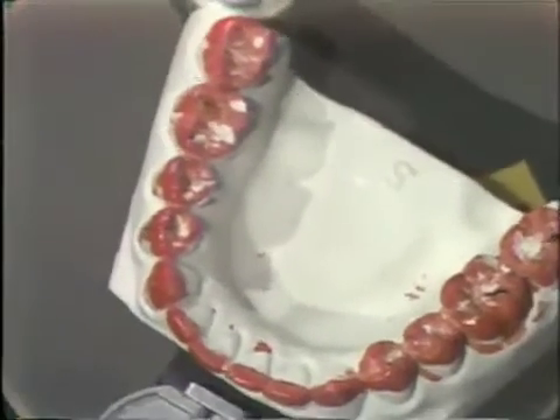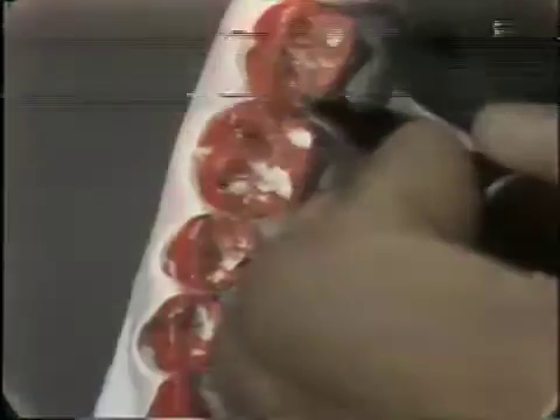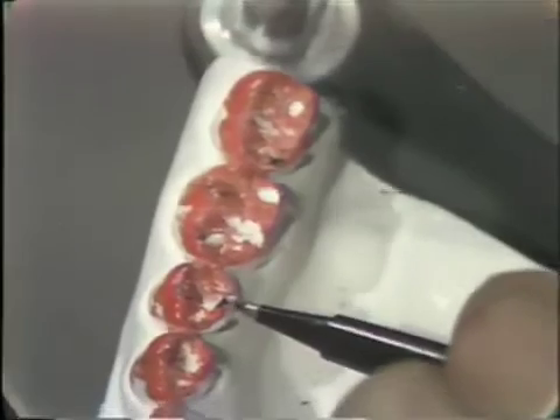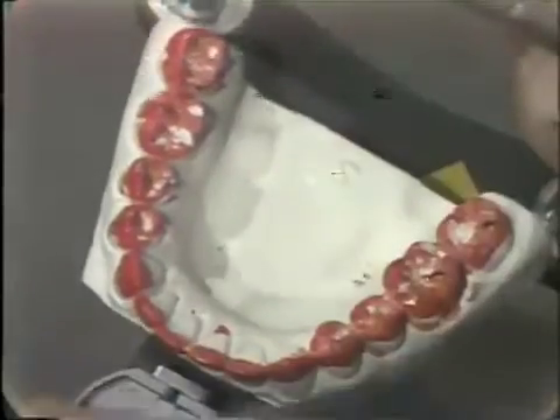If we go to the opposing side on the lower, we will notice that we have a contact here on this lingual cusp — this is a working contact, the lingual of the lower. We also have a working contact here. Since the working contacts are not favorable on this side, these are unfavorable working contacts and they will have to be removed. This is the lingual of the lower portion of the BULL rule, which is the buccal of the upper and the lingual of the lower.